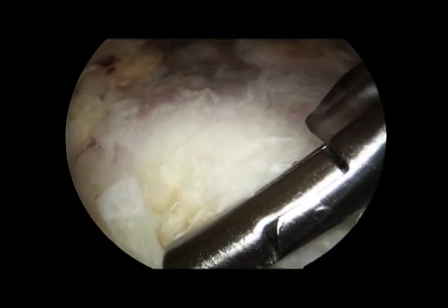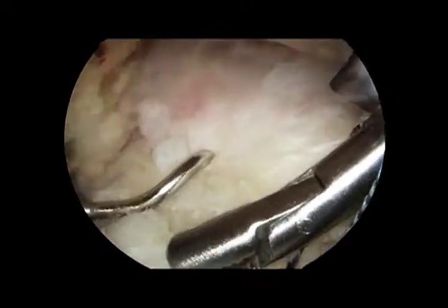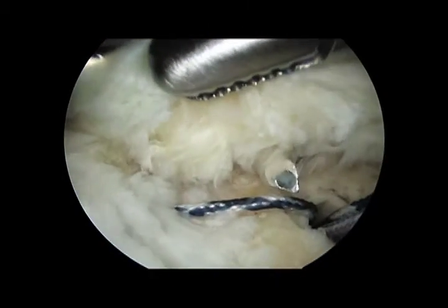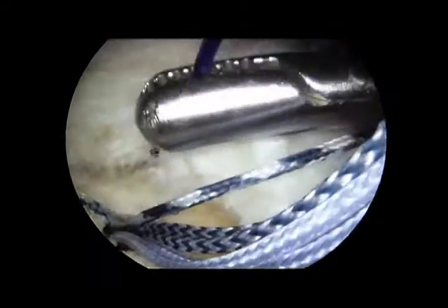So the tendon edge is held in a slightly medialized position on the footprint while a suture shuttling device pierces the tendon in an appropriate position. A PDS suture is used to shuttle the partner suture limb out the posterior cannula, making a horizontal mattress configuration. Not shown is retrieval of the medial limb of the middle suture out the anterior cannula.